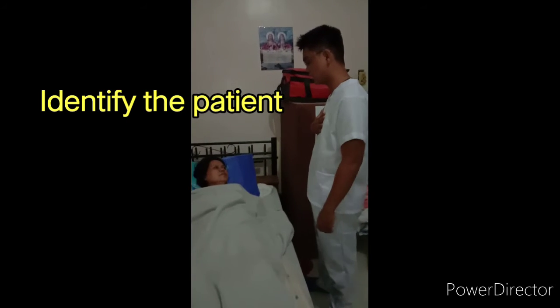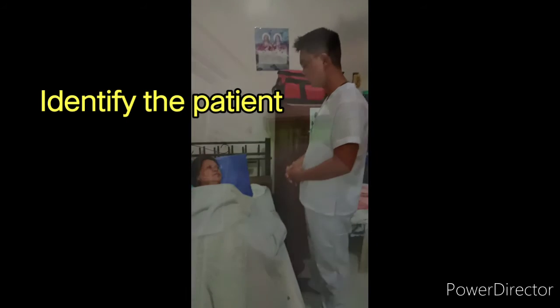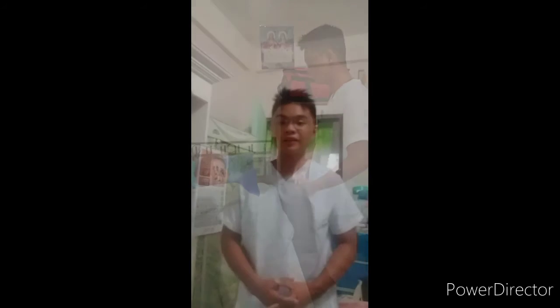Good day, ma'am. My name is Joseb Rosas. I'm your nurse today. Next, we have to close the door or curtains to give the patient privacy.